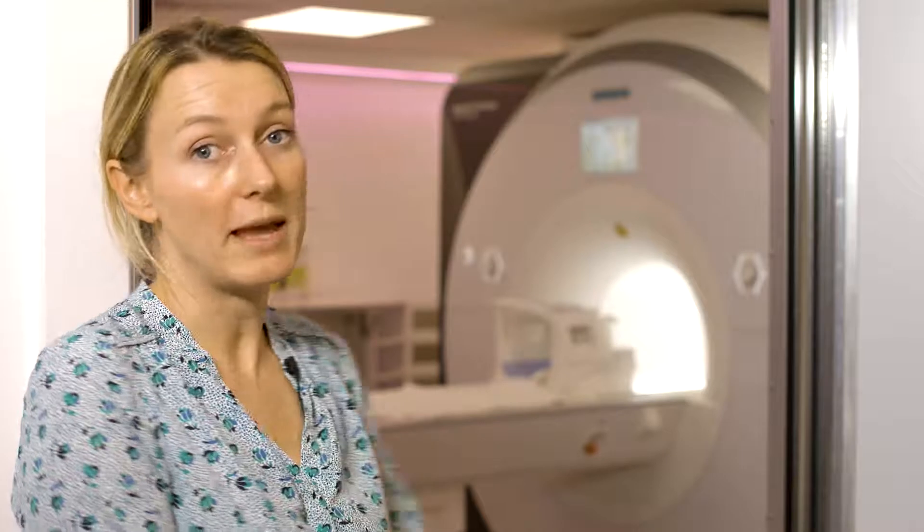When they're ready for the scan, you'll then be walking into the room and lie on the MRI table as you see there. We then fix ECG stickers so we can monitor your heart during the procedure, and then the table will go into the scanner.